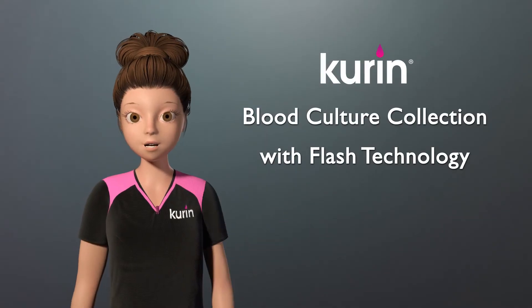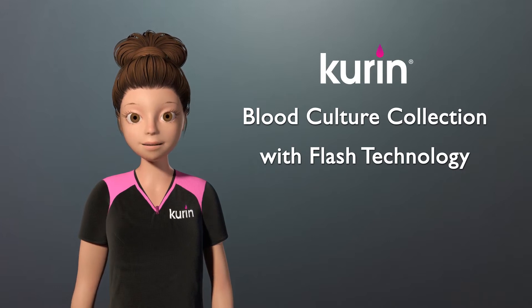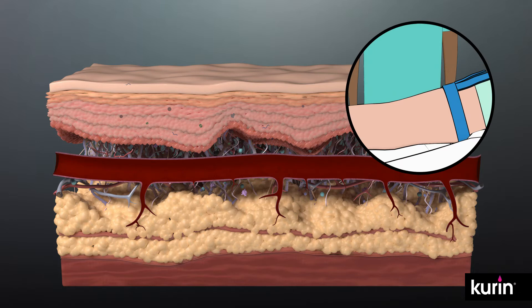The Curin lock with flash technology sidelines the initial flash of blood from an accessed vein to reduce skin contaminants that enter into the blood culture sample. 20% of normal skin flora resides deep within our skin, so it is impossible to sterilize the skin even with perfect aseptic technique.